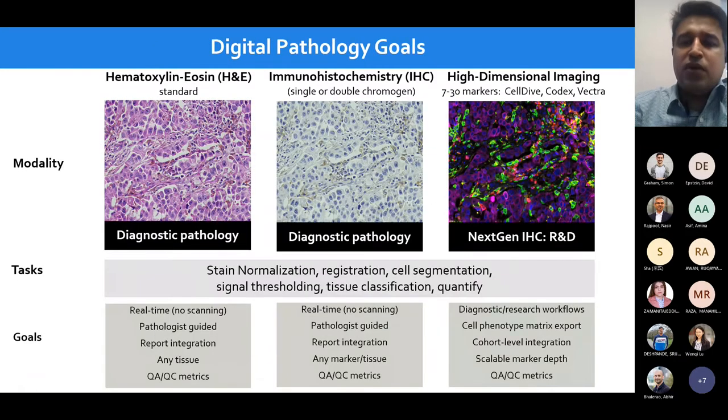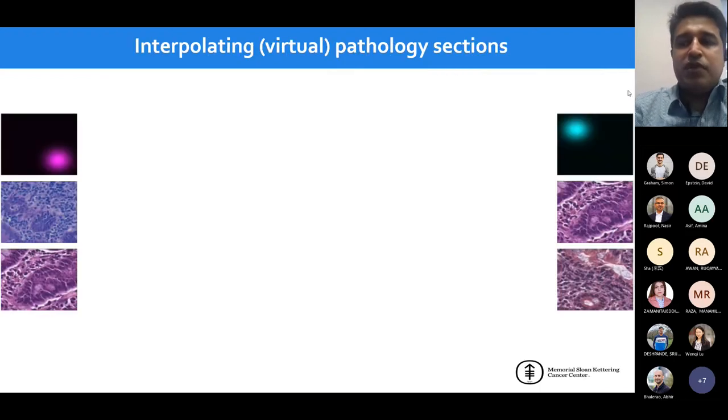So moving on. All right, so the first part I presented was stain normalization, where we can derive Wasserstein barycenter interpolation in the color space. But all right, that's interesting, but what more can we do? So then we've been working in our group, before I started my postdoc, in the vectorial optimal mass transport domain, where rather than transporting scalar distributions, we can now transport or match vectorial distributions too, where the vectorial part comes from either RGB colors in a colored image, or it can also come from other kinds of modalities as well.